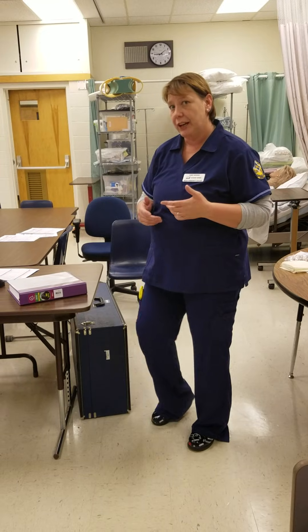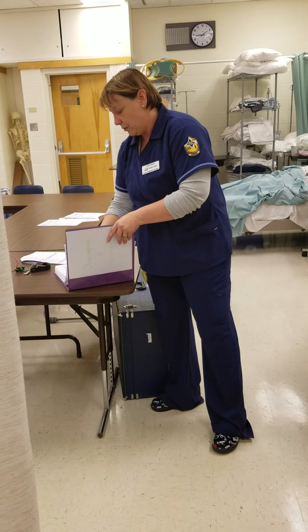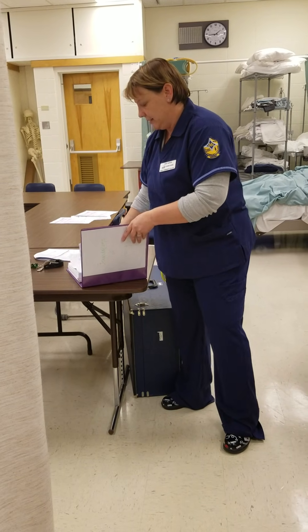This is an instructional video on how to collect a sterile urine sample from an in-dwelling catheter. The first thing I'm going to do is check the patient's record and make sure that the physician is still ordering the collection of this sample. And it looks like he is, so I'm going to go ahead and gather my supplies.